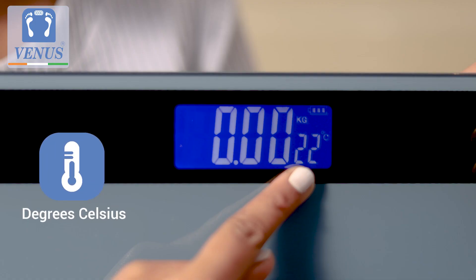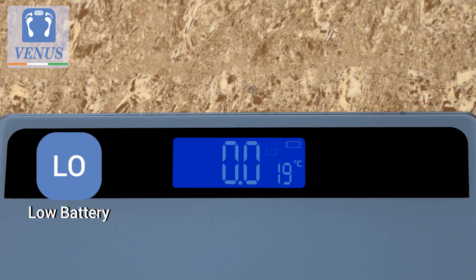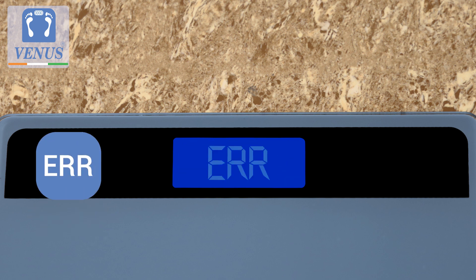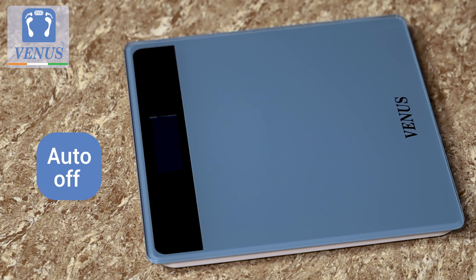The scale also displays the room temperature in degrees Celsius. The display is easy to understand: LO indicates low battery, OL for overloaded, or ERR for an error in the reading, and it comes with an auto-off feature.